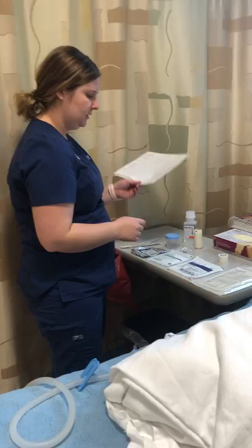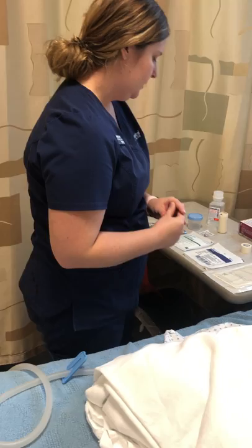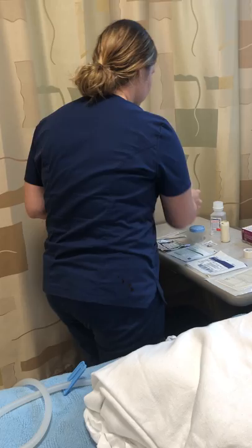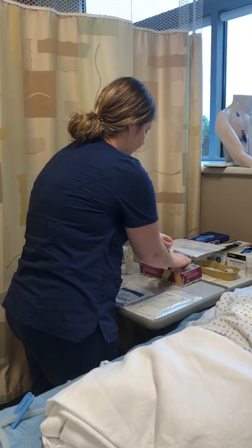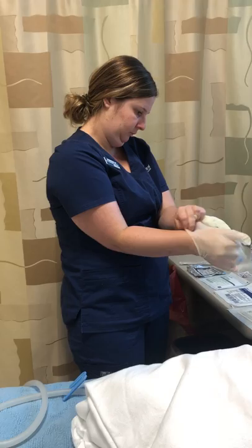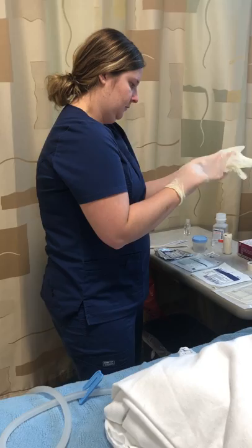Have you had your dressing change done before? She says, yep, she's had it done. So you know what to expect when I'm doing this. She says, yep. Then the first thing I'm going to do is wash my hands again. Then I'm going to put on some clean gloves here. Sorry, taking forever to put my gloves on.